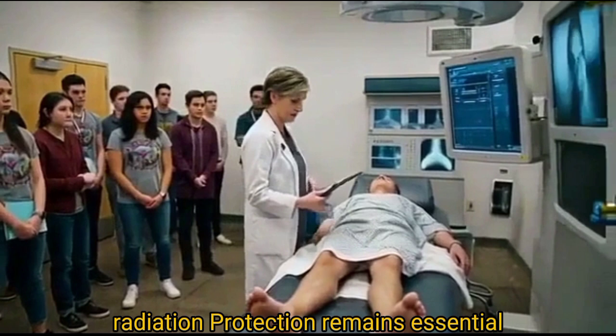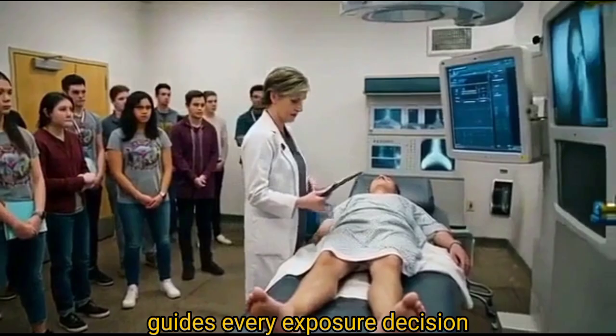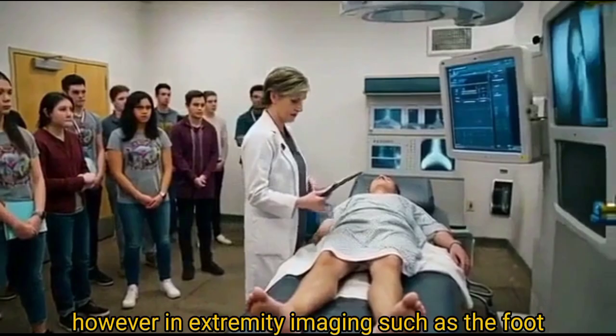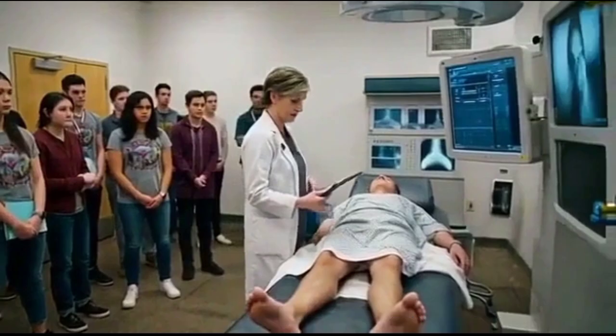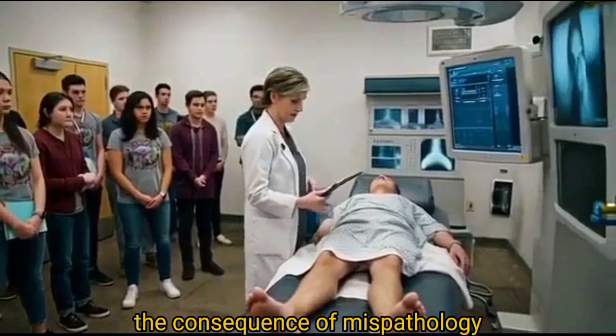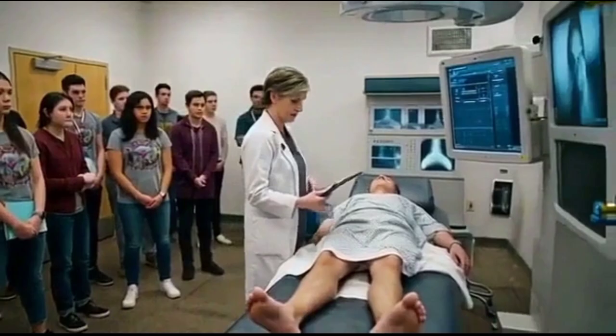Radiation protection remains essential. ALARA, as low as reasonably achievable, guides every exposure decision. However, in extremity imaging such as the foot, diagnostic clarity becomes the priority. Because in diabetic foot disease, the consequence of missed pathology is far greater than the risk of radiation exposure.